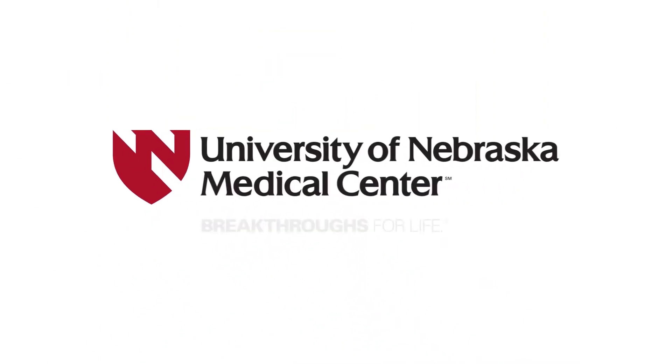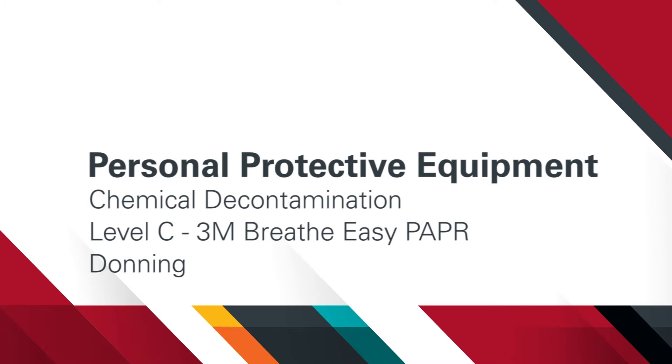In this video, we demonstrate the steps for donning Level C Chemical Personal Protective Equipment with a 3M Breathe Easy PAPR. Decon operation team members often wear Level C Chemical PPE when attending to a patient requiring chemical decontamination. We will walk through what equipment you will need and demonstrate the steps involved in donning it successfully.